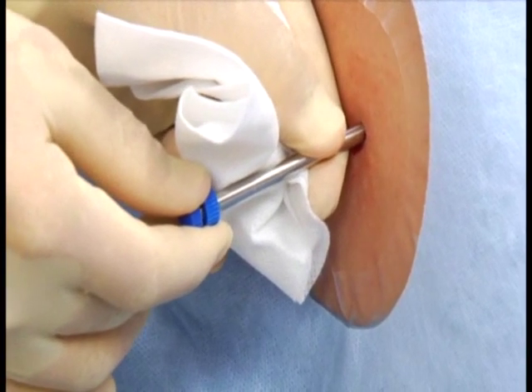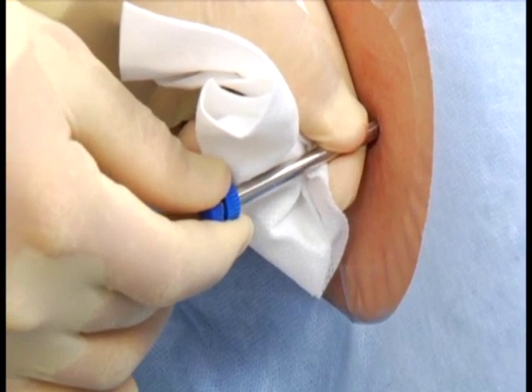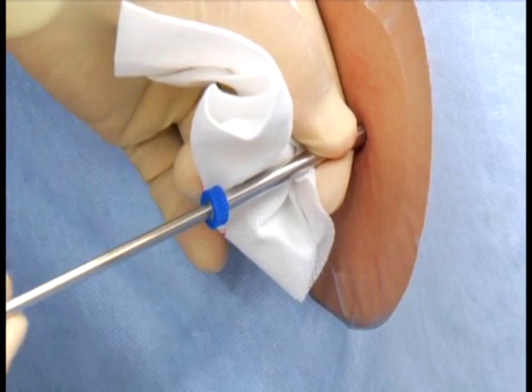Once the cannula is positioned, the trocar is removed and placed on the sterile utility drape of the working area.